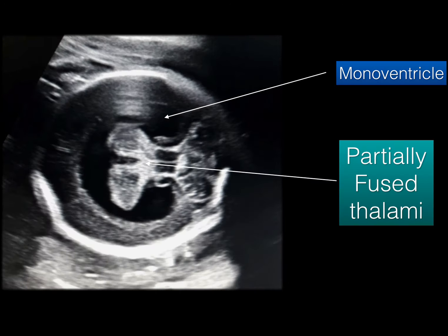A 23-year-old pregnant lady came for an anomaly scan. Let us see the USG features. This is the axial section of ultrasound of the fetal brain. You can see the classic bilateral thalami which are partially fused here, and you can see the ventricle is single, which is called a monoventricle.